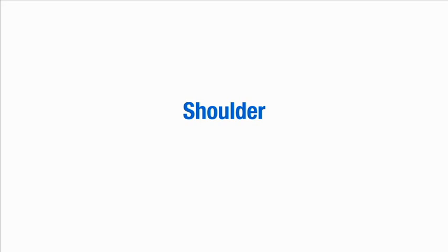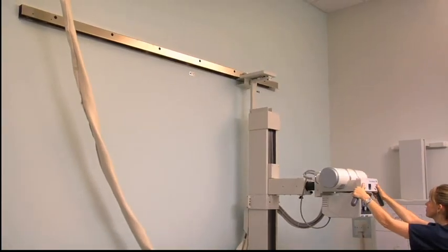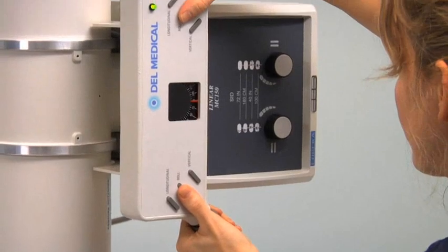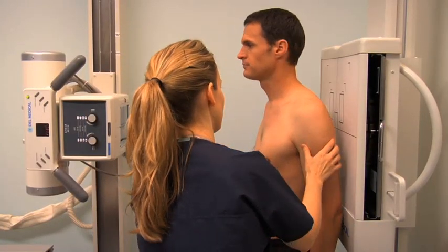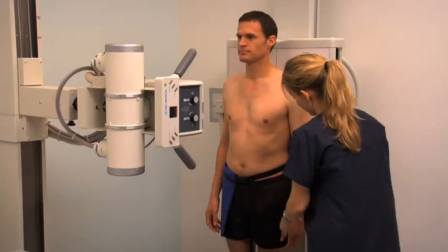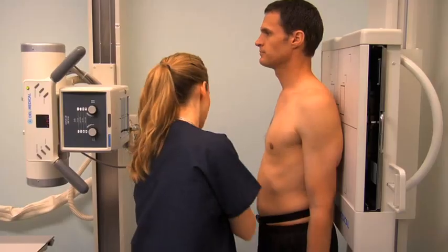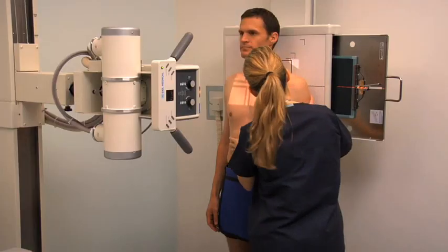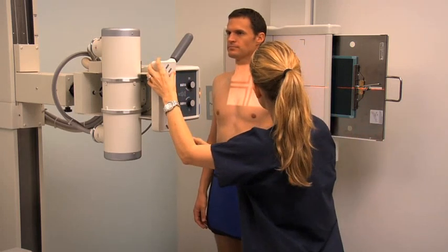To obtain a radiograph of the shoulder girdle in the AP projection with the humerus in external rotation, select a 10-by-12-inch cassette and place it in the upright bucky. Set the SID to 40 inches and align the central ray perpendicular to the image receptor. Select the upright bucky setting and the small focal spot. Set the exposure parameters to between 65 and 70 kV and 12 and 16 MAS. Ask the patient to stand against the upright bucky with the posterior aspect of their shoulder in contact with the image receptor. Externally rotate their arm to position the hand in supination, moving the arm just away from the body. Position a lead shield over the reproductive organs and center the glenohumeral joint to the image receptor. Center the central ray one inch inferior to the coracoid process.